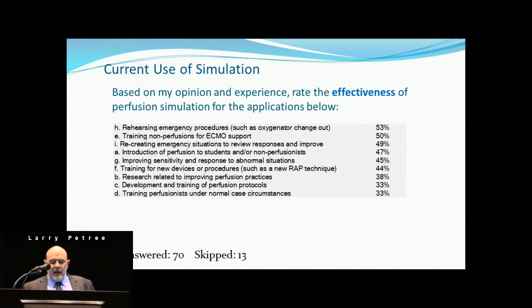The next question I asked was, based on my opinion and experience, rate the effectiveness of perfusion simulation for a number of different applications. The highest ranking, again, no surprise, was rehearsing emergency procedures, such as a changeout. Training a non-perfusionist for ECMO support was also highly regarded. And then interesting, recreating emergency situations to review and improve responses.